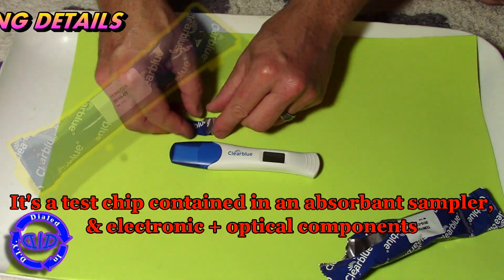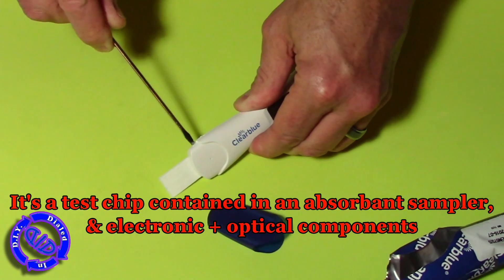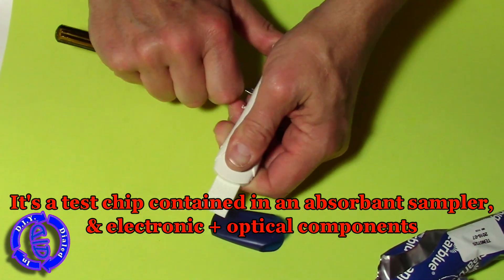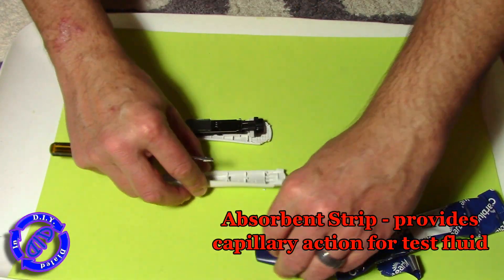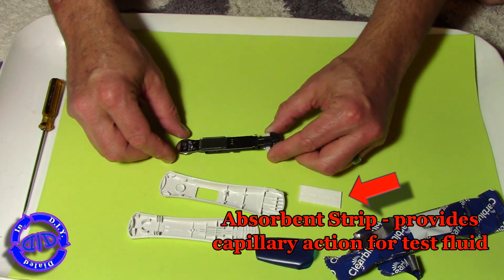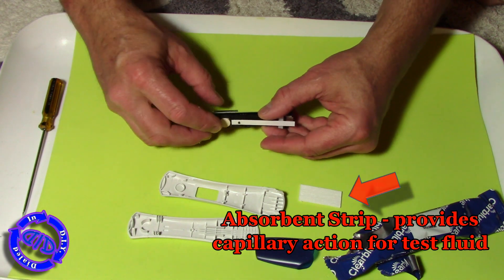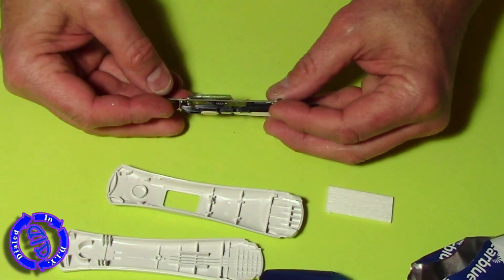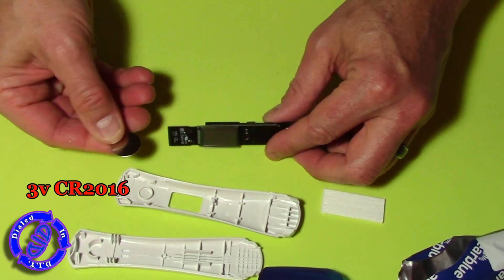We'll start by taking it apart. With the digital test kit, it works very much like your traditional kind of test, except this time you have an actual test chip inside that uses an optical reader to look at the results you get on the blue lines. While these are sealed quite well to keep moisture out of the components, it's easy to crack apart. The big part here is the absorbent strip that works much like a straw to get the fluid to the test area, using a wicking action, which is why they consider this a lateral flow test.